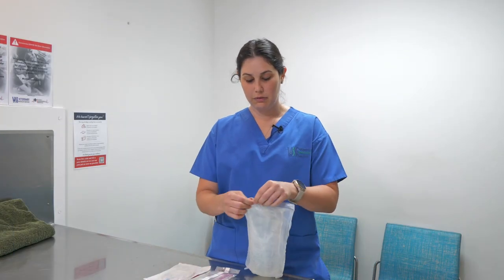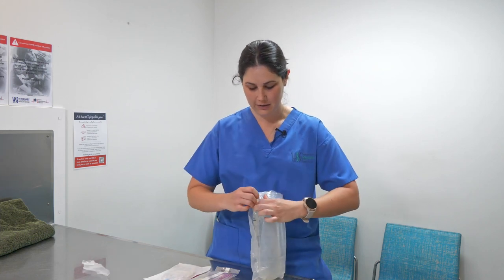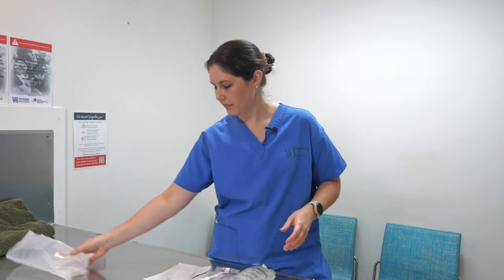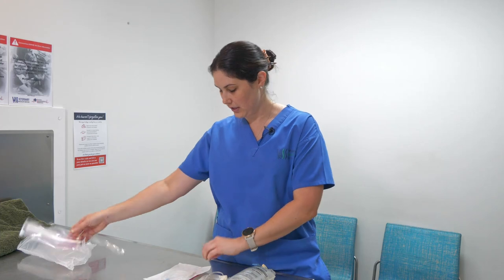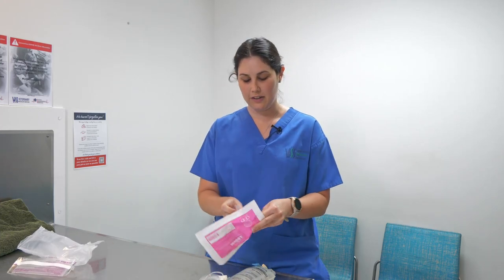First off, what we're going to do is open our packaging. There are little grip tabs at the top for these — pull straight down and open up. It's the same with all of these; there's a little tab just at the top to make it nice and easy, and a little opening there as well.